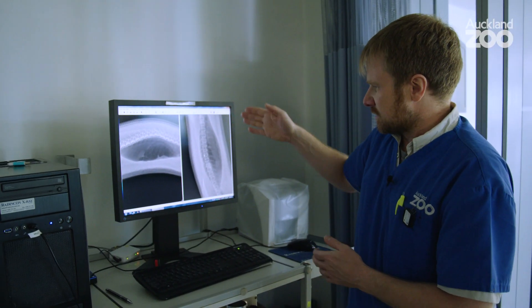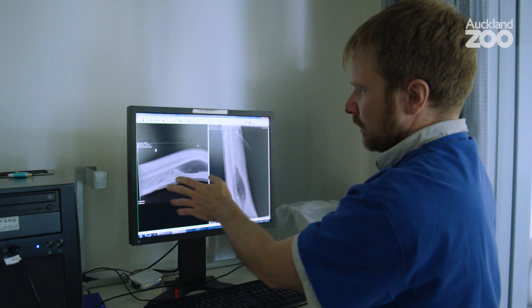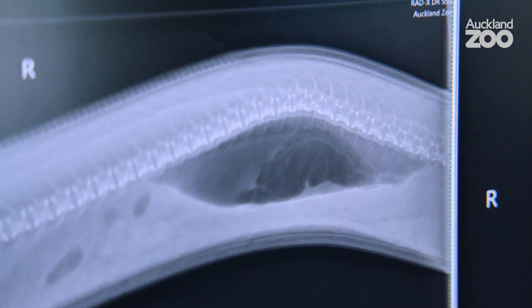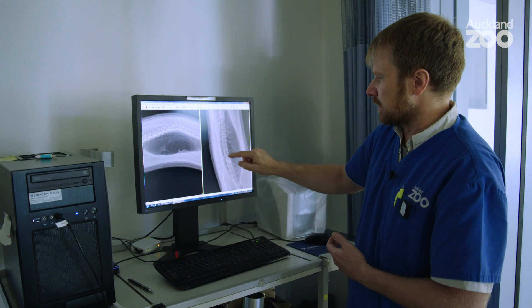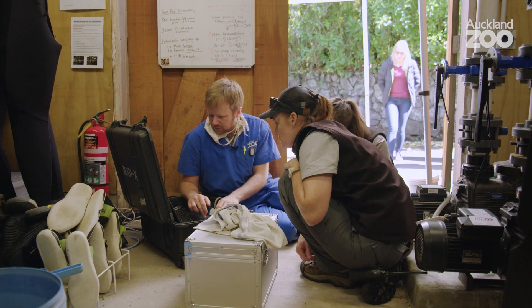This is the side-to-side view, this is the top-to-bottom view, and here are the vertebrae — the bony bits in the middle — with muscle on top and abdominal contents below. This is the swim bladder. You've got a curve in the spine, which is not normal, and there's collapse of the space between the vertebrae at the lesion site. There are no fractures, so no evidence of trauma. One thing that can cause this in fish is low vitamin C — vitamins can degrade over time — so we need to review how we're providing vitamin C and make sure it's as good as it can be. That investigation will lead us to action or further investigation. This is the start of the process, and it will be another few days until we know the end result.